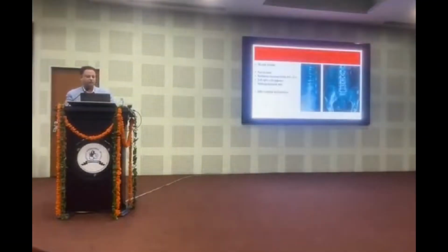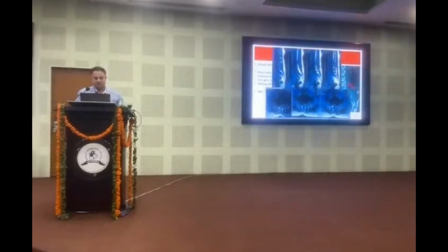This is a 40-year-old female with pain in the back with radiation to both legs, and SLR on the right side being 20 degrees. And you can see the distances and the stenosis there. The MRI picture.